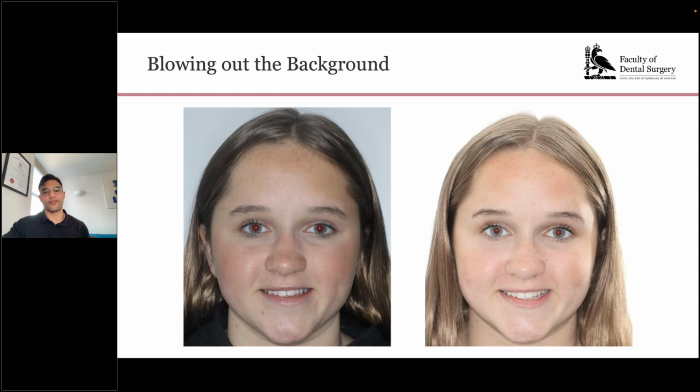And so when you take the photograph, it overexposes the background and makes it absolutely white. And it gives you a professional quality to the photograph that you don't necessarily get when you've got a non-white colored background. So I hope you all agree that the photo on the right is better than the photo on the left. And often a troublesome feature of many photographs is red eye. Essentially, the eyes are immensely reflective. Light travels through the eye to the retina, and the blood vessels in the retina, which are obviously red, are reflected back into the lens of the camera.